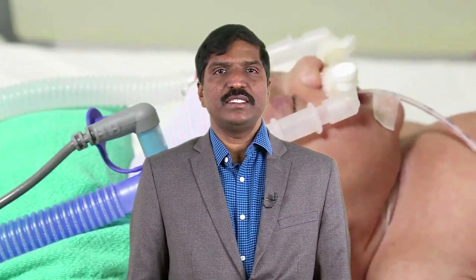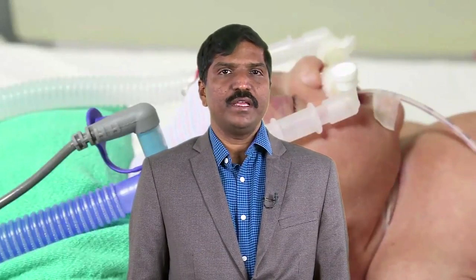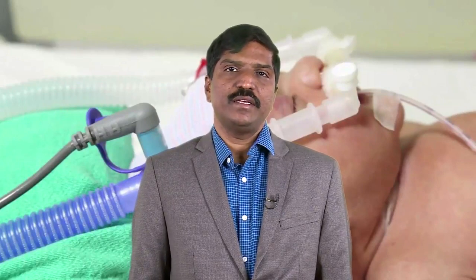If the saturations are less than 90 percent, there are no recessions, good air entry, and bubbles are present in the bubble chamber, this would indicate either a cardiac disease, pulmonary hypertension, or blender malfunction.